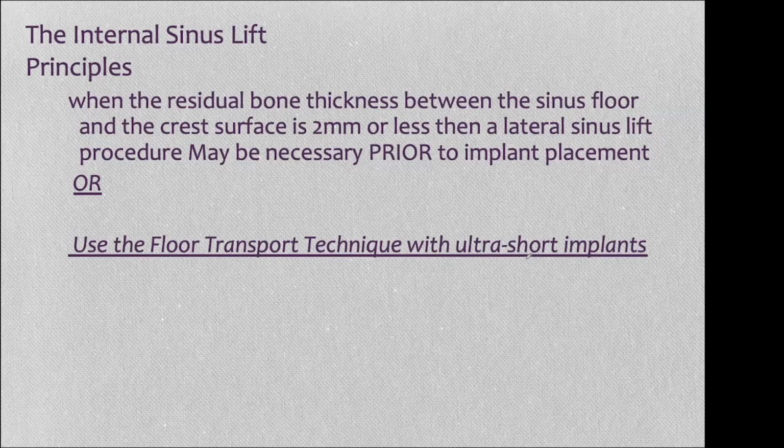Well, what if I needed to lift it more? Say I want to place a 6 millimeter long implant, but I only have 1 or 2 millimeters of native bone. And so to put that plus the 6 and another couple on top, I'd have to lift it about 8 millimeters.